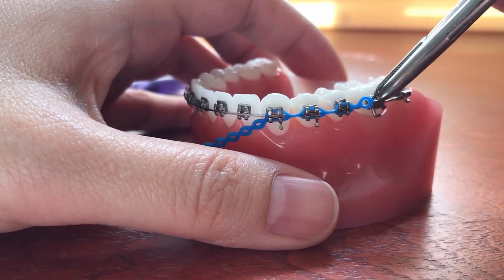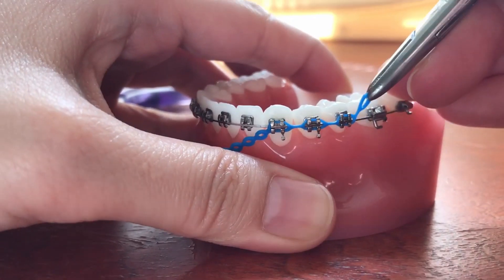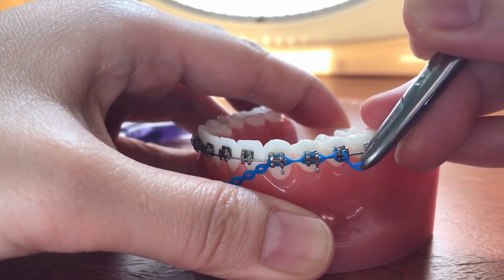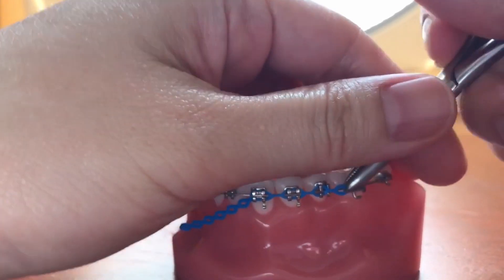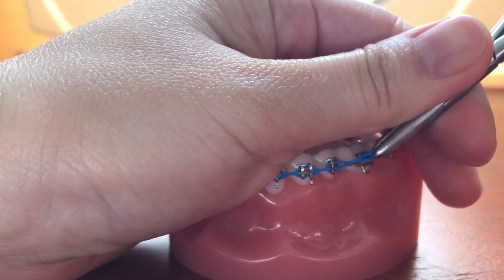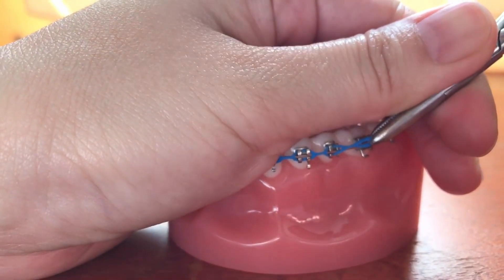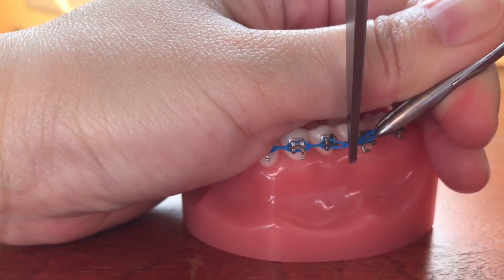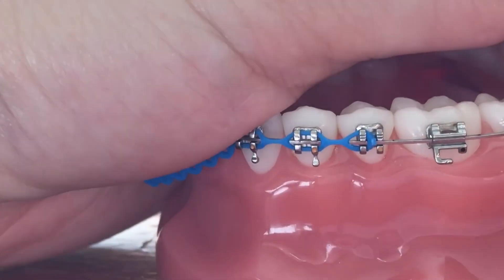This section right here that I'm grabbing is the broken power chain. We're going to grab onto that and pull it to get it off the back half of the bracket. You should pull backwards just like I'm doing here, then grab some scissors and clip off the broken power chain.